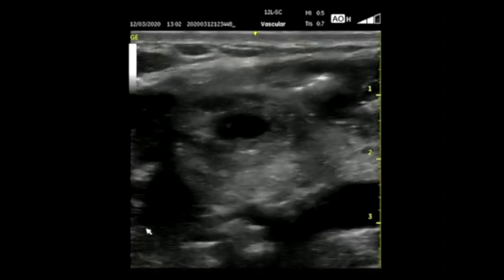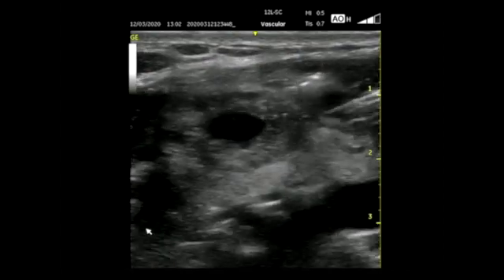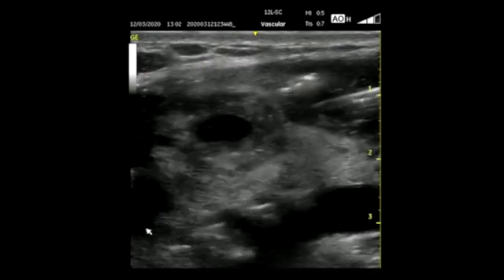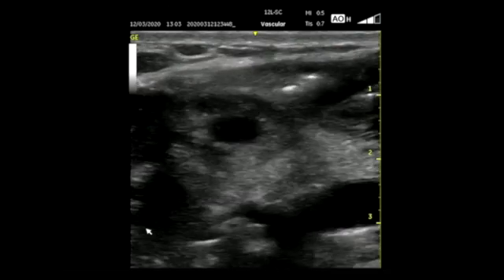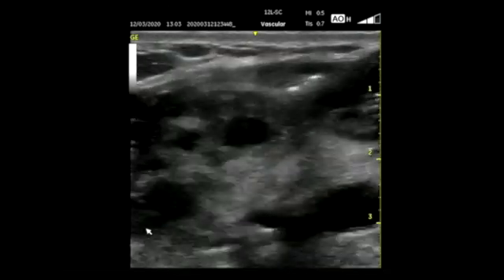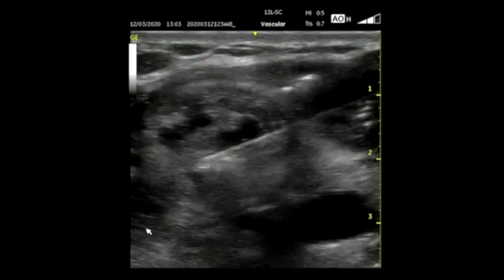On the right side of the screen you will see the probe enter the thyroid nodule. The probe is a little bigger than the needles we use to draw blood. This procedure is performed under generous local anesthetic and patients tolerate it very well.